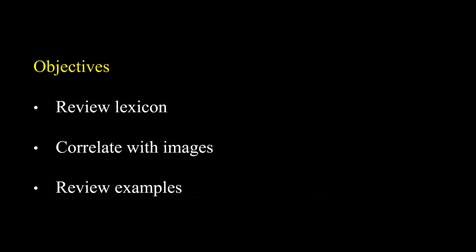My objectives for this talk are definitely the first 2: to review the lexicon of TI-RADS and correlate it with images. And if we have time, we'll try to go over some examples.